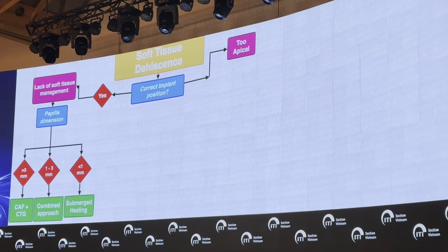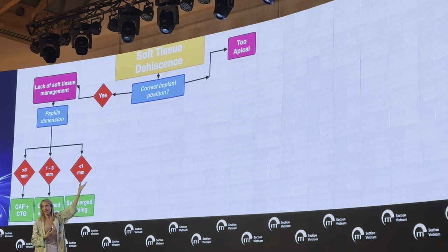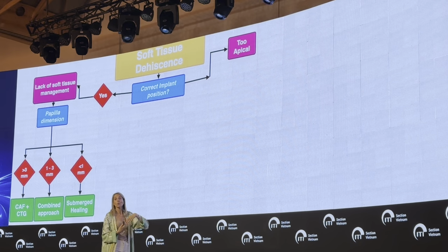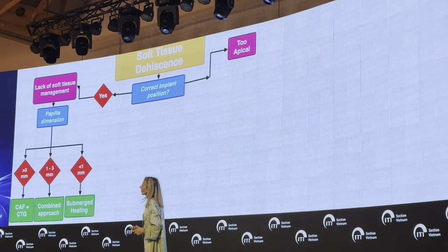So now we move to the second part of the decision-making process, because we have to deal with the majority of the case that belongs to implants that were placed in the wrong position. And so the implant is placed in a wrong position.